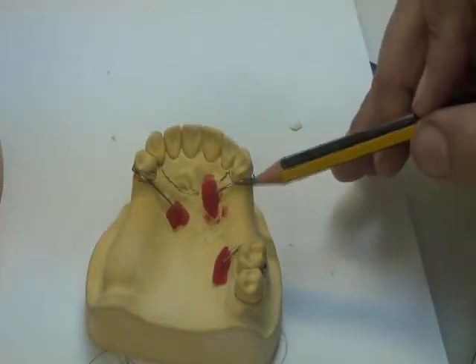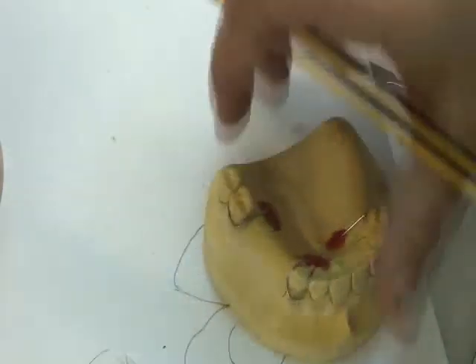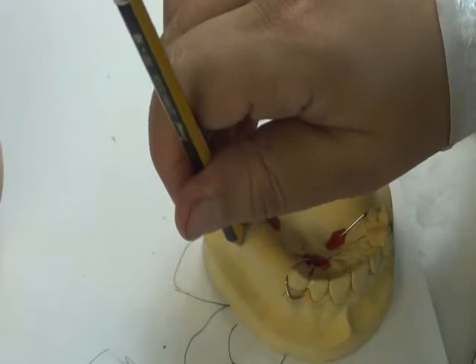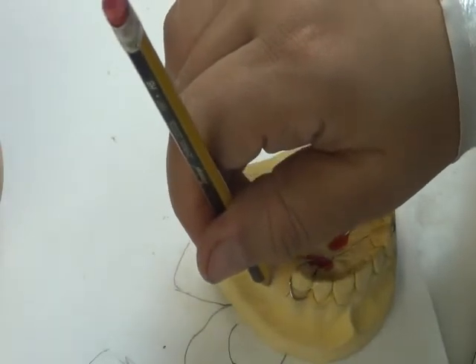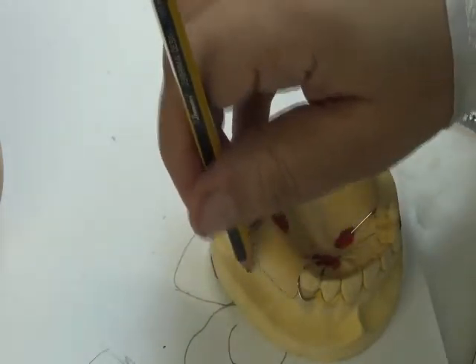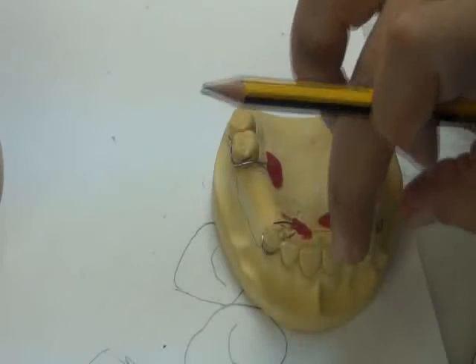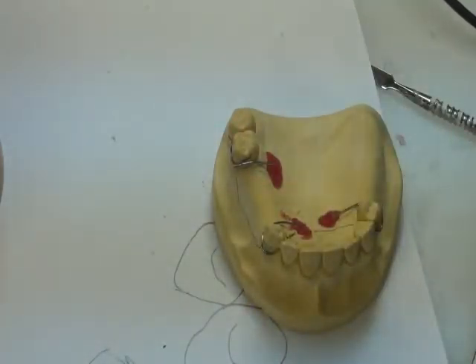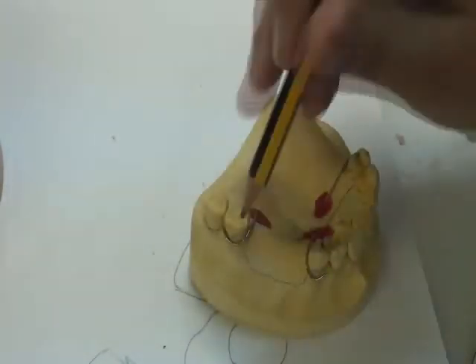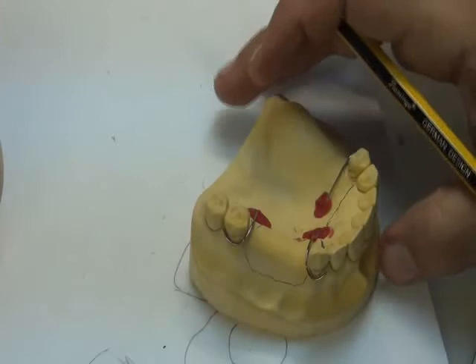I will go from beside the tooth vertically down. In the bounded area, I do not need to reach the full extension of the sulcus. I could come short like this, and this is enough for me. I don't need to go into the sulcus, unless I'm in the anterior area and the patient has a gummy smile, then I need to extend the acrylic. But in bounded areas posteriorly, I do not need to go to the full extension on the cast, in the border area.